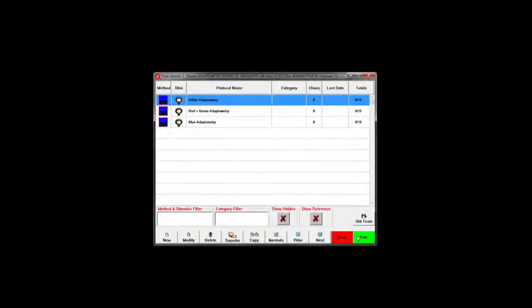Begin a test by pressing the start button. Click protocols to move to the protocol menu and select the appropriate dark adaptometry test.